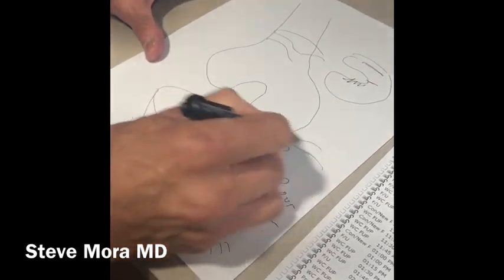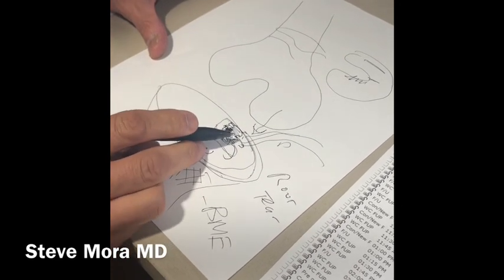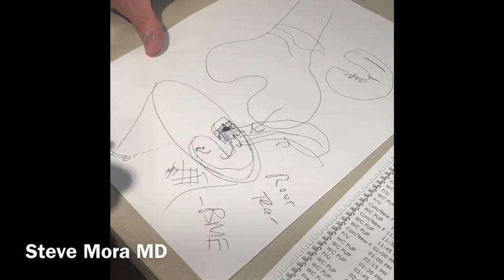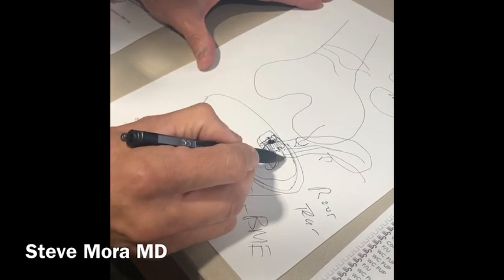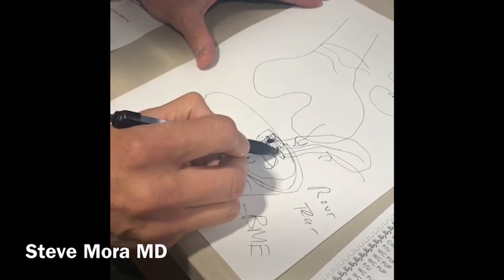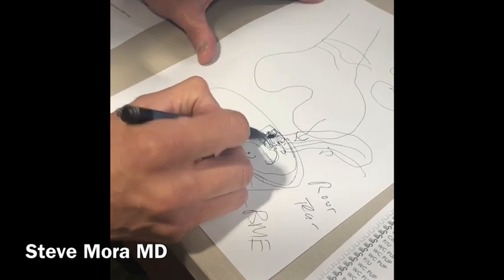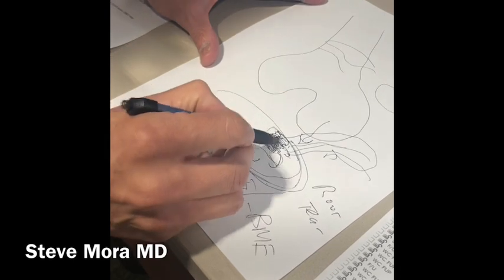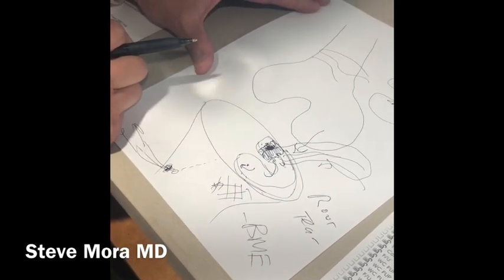We attach some sutures onto the posterior horn that's torn, and then we pass those sutures into the hole, out this hole, and then we pull really hard, and when you do that, it actually reduces the torn posterior horn into this bony bleeding bed, and then you tie a knot over here in a special way, and eventually this spot welds itself, and that's called root tear repair of the medial meniscus.